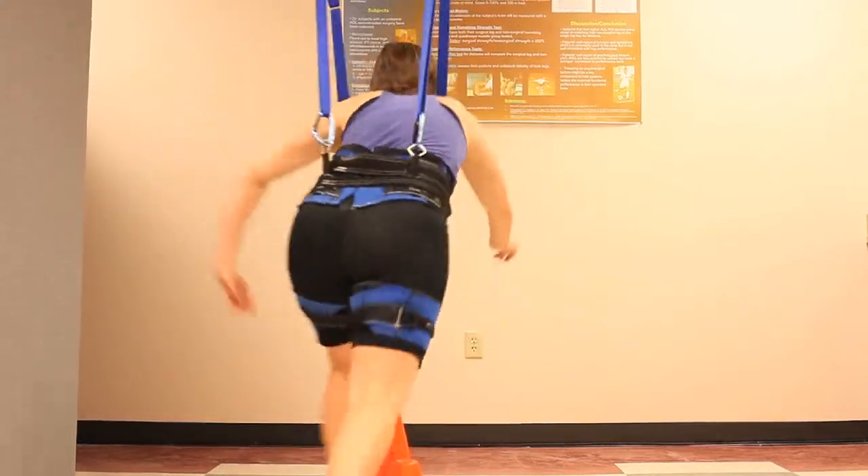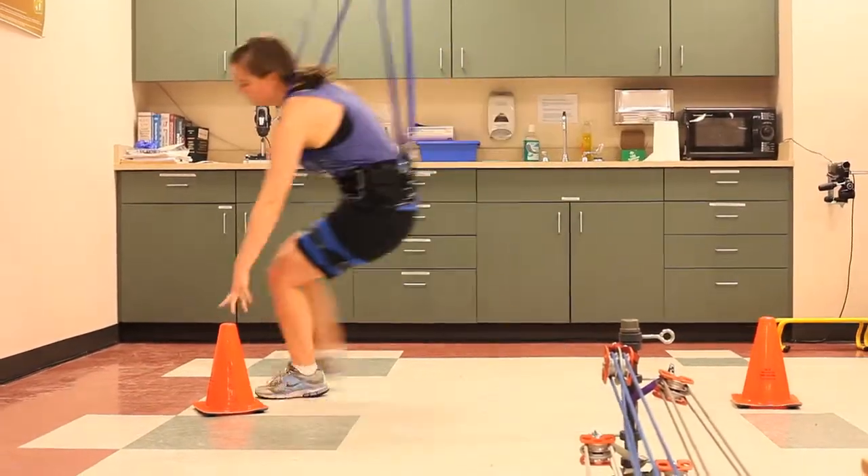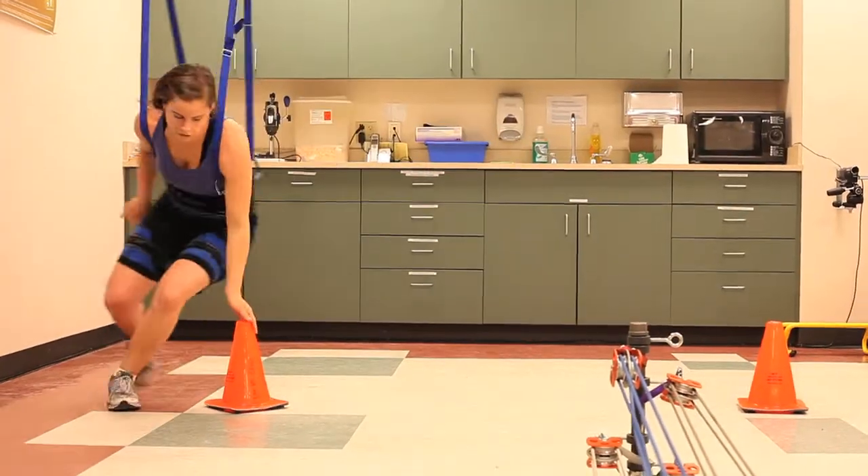We've worked for the last year and a half and we think we've developed a technique and a tool to do that. We've started some preliminary work retraining those athletes with that tool.